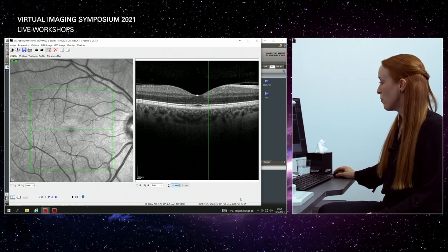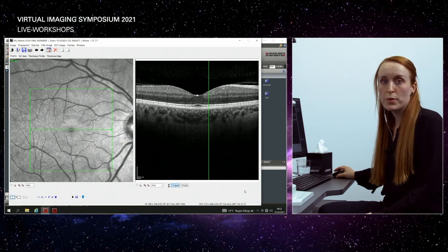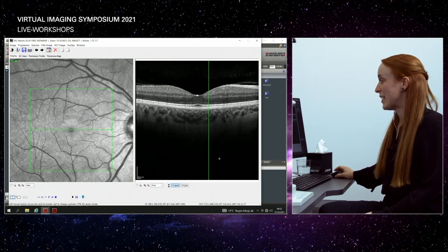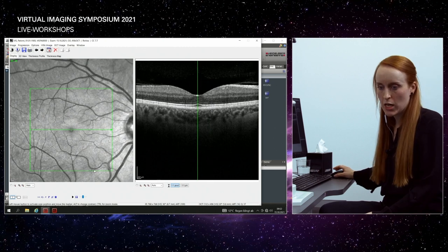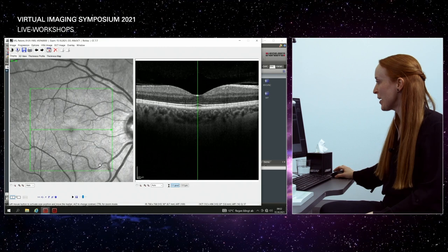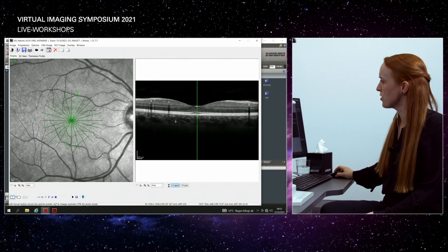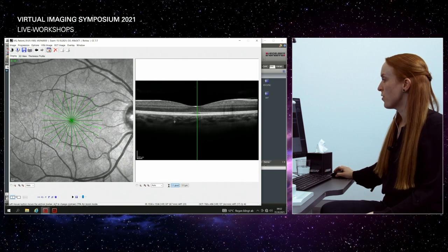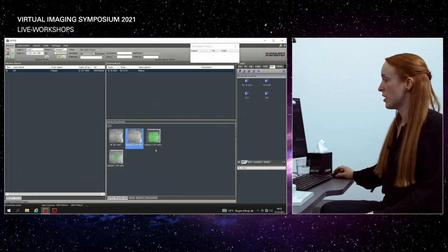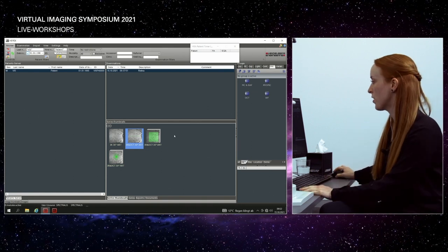So this number on the lower right corner, this Q value, should be above 25 for a good image, but it's regarding the patient and his or her optic media, if they are clear enough, you know? Okay, but for now, I think those baseline images are quite good. As you can see, our star shape pattern is really right in the fovea, and you can imagine that we have the possibility here to detect even the smallest change in this foveal architecture.